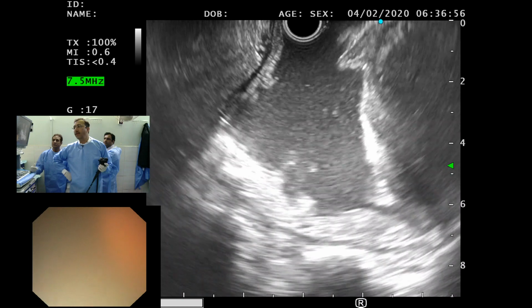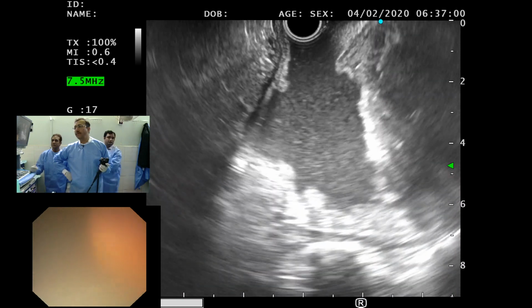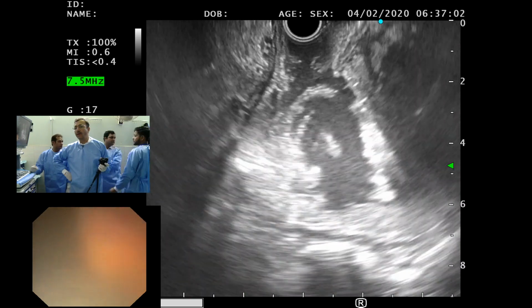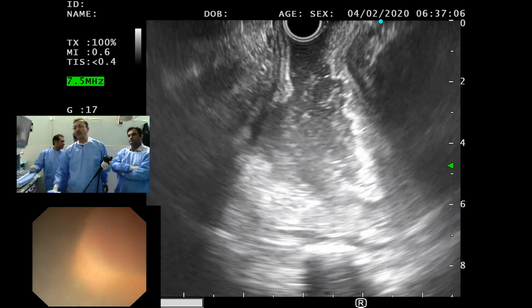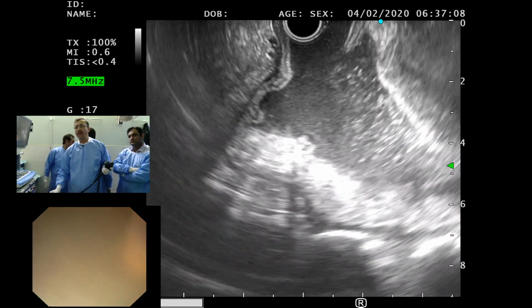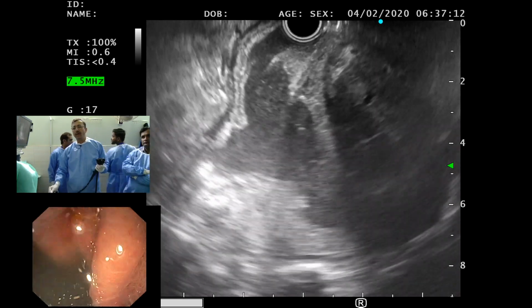Can you hear me? We are with you, sir. Okay, but we have plenty of fluid in the stomach, so I'm trying to suck it out. Before giving it to the candidate, I'm going to suck out all the fluid.